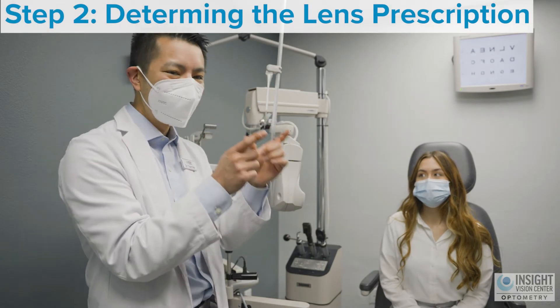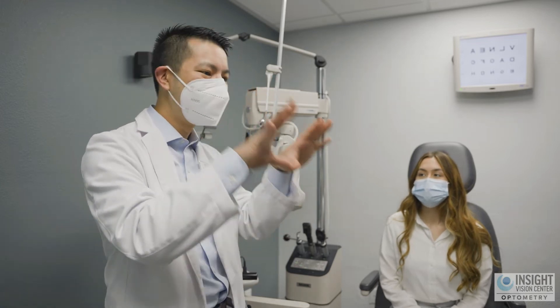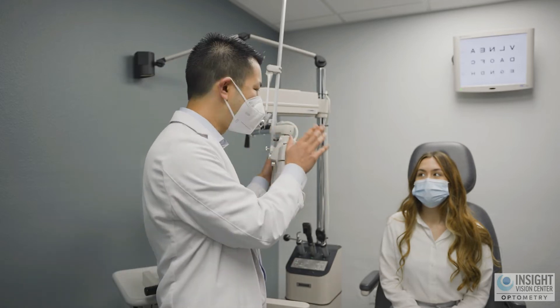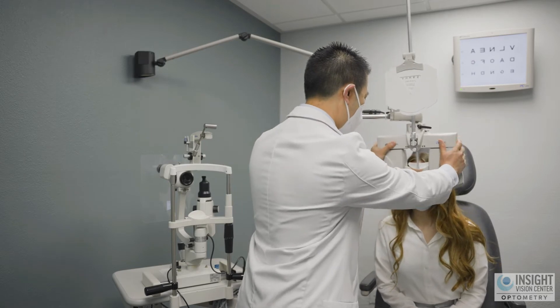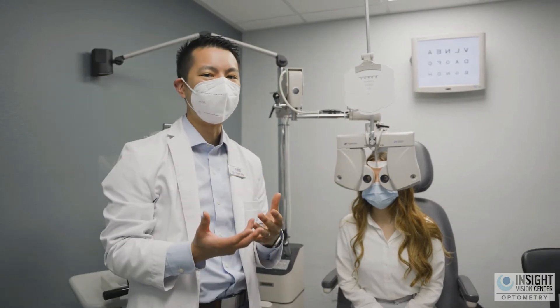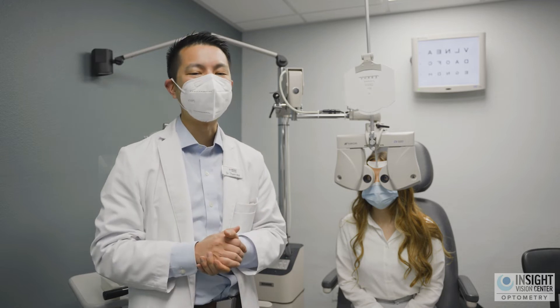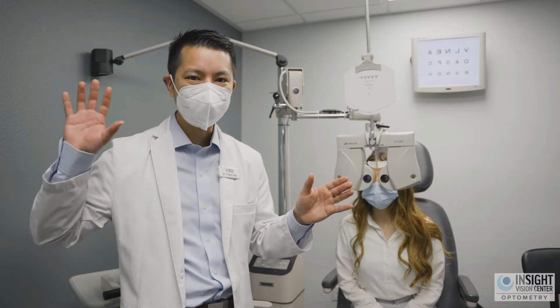After you've determined the shape of your eye by taking the scleral topography, we know the design of the lens we need, but it doesn't tell us the prescription. So after putting on the trial contact lens, we'll have the patient wear it and use the phoropter — playing that familiar game of 'what's better, one or two?' — to determine the right prescription for the scleral contact lens. Step one is the shape; step two is the prescription.